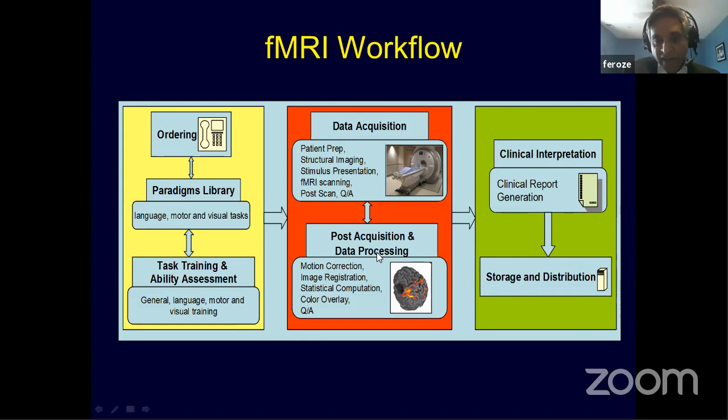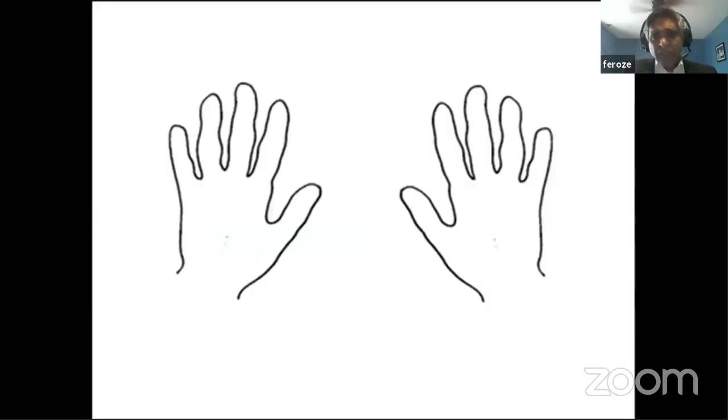Again, there are a few vendors that actually provide the software for clinical utility and also connectivity to the neurosurgical suites so that images can be seamlessly transferred. And then, of course, it needs to be stored for interpretation, and it's also very important, into PACS for distribution.